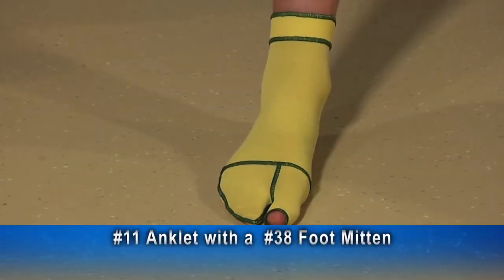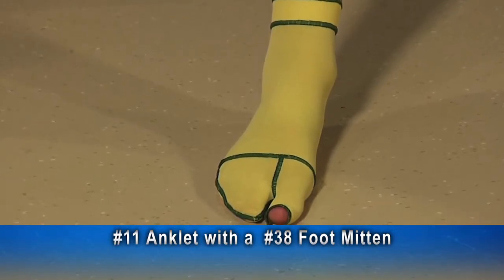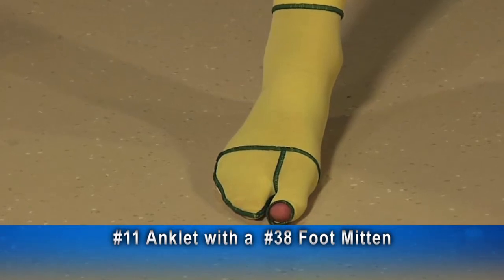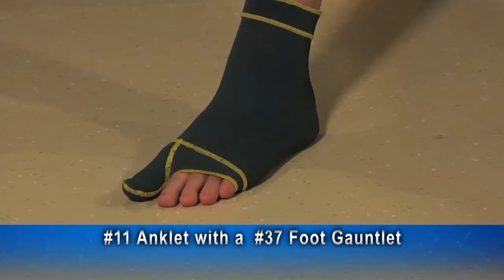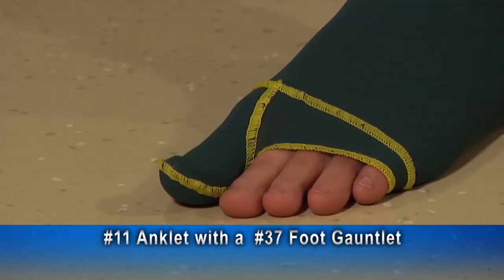A number 11 anklet attached to a number 38 foot mitten. On the example shown here, the great toe piece is open. The other toes share a common covering. This number 11 anklet with an attached number 37 foot gauntlet, here the great toe is enclosed and the other toes share a common opening.